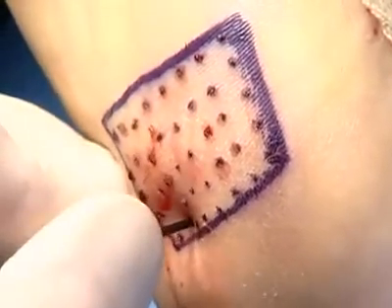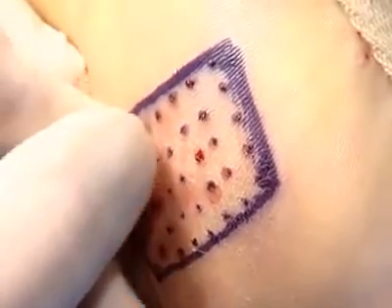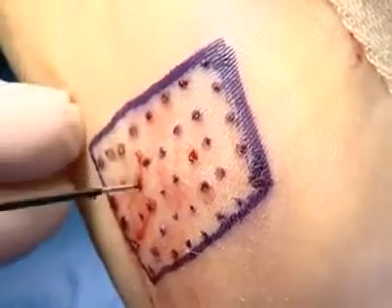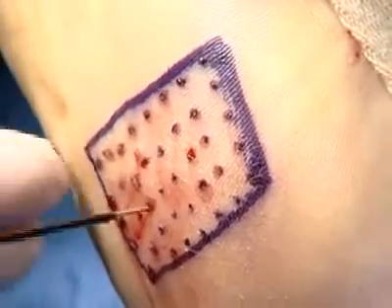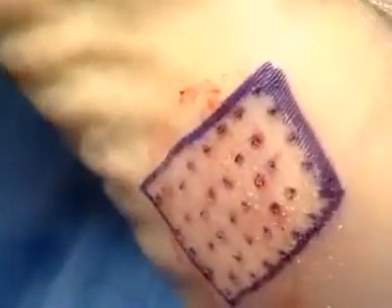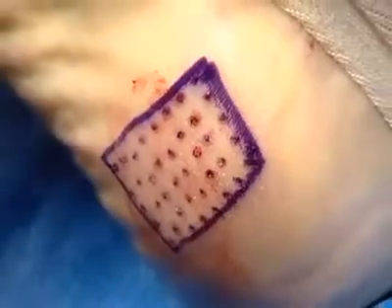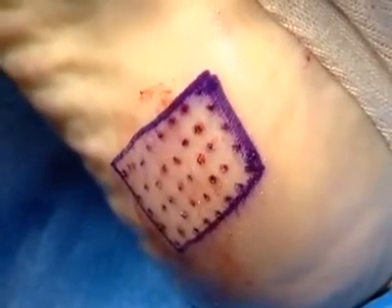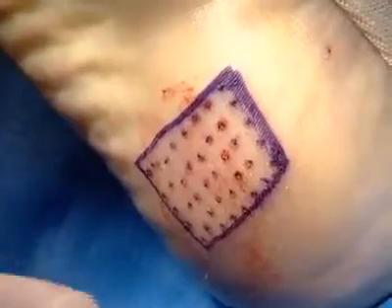The patient will be able to return to normal activities of daily life as quickly as 2 days after surgery. They will find improved pain as quickly as 1 week after surgery, and typically healing takes 6 to 12 weeks. We have found that this procedure has offered quicker pain relief than releasing of the plantar fascia in a more typical fashion. Additionally, we have found less postoperative pain and complications that may be associated with the release of the plantar fascia, such as lateral column pain and nerve-related symptoms.